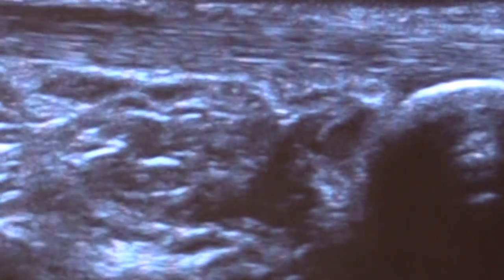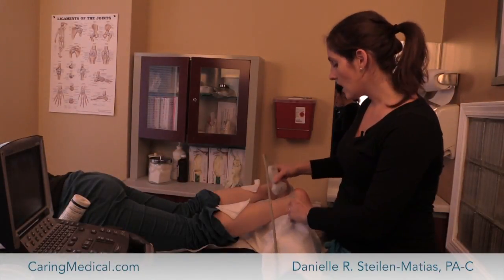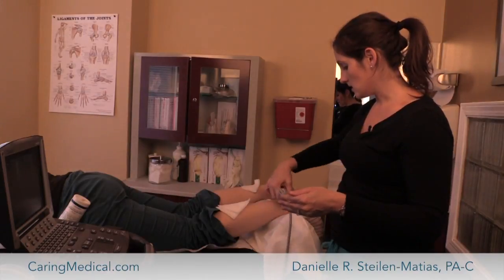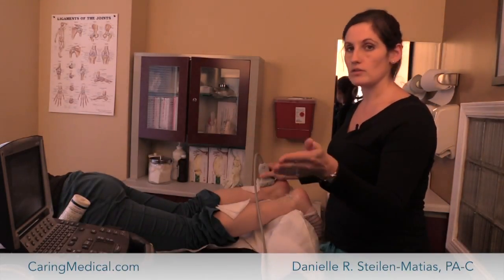Sometimes what will happen is that you might look at this and think, oh gosh, maybe it is a little thick, maybe it's not. And the great thing about ultrasound is that it's so easy to just take some gel and hop over to the other side and compare the two together.